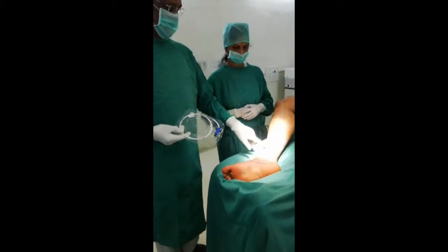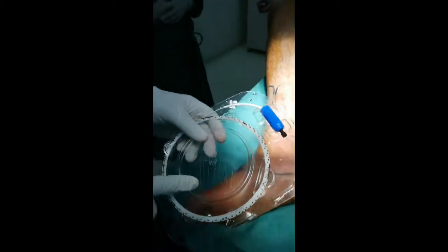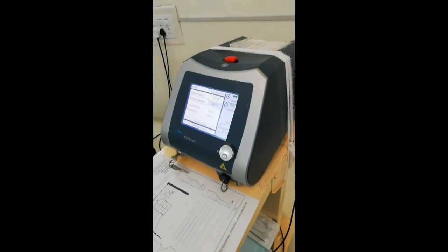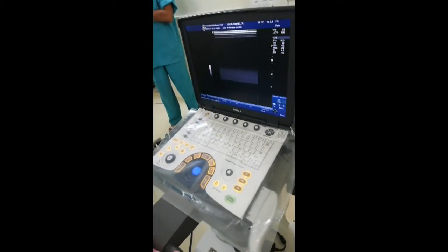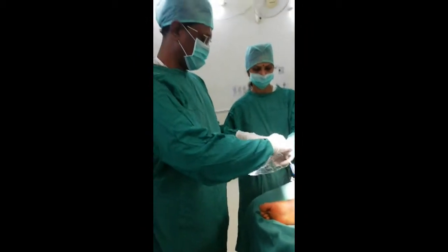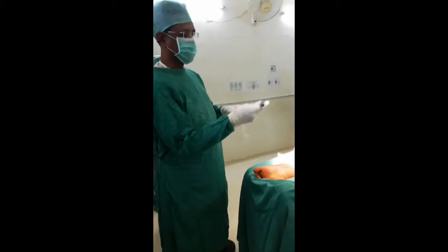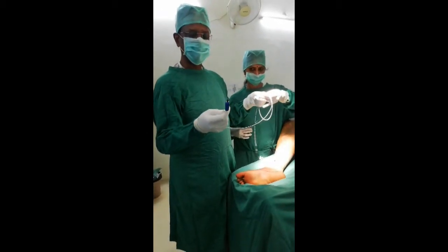We have got an access point here — this is called an access point — and we got a 6 French access point into his great saphenous vein. This is the fiber, this is the radial fiber; the tip is rounded, I will show you later. That is the 1470 nanometer biolytic laser machine with the intraoperative ultrasound, that is GE Logic E with a high frequency vascular probe. Now we will see this fiber taken out from its holder — this easily goes into a 6 French access sheath. This is the connector end which goes into the laser machine. This has very limited usage; unlike other machines which can be reused, this cannot be reused.